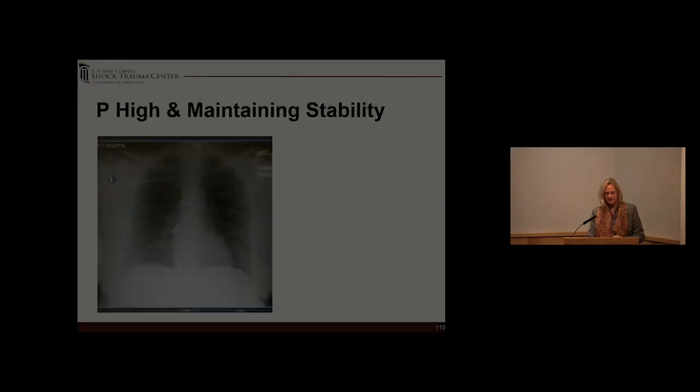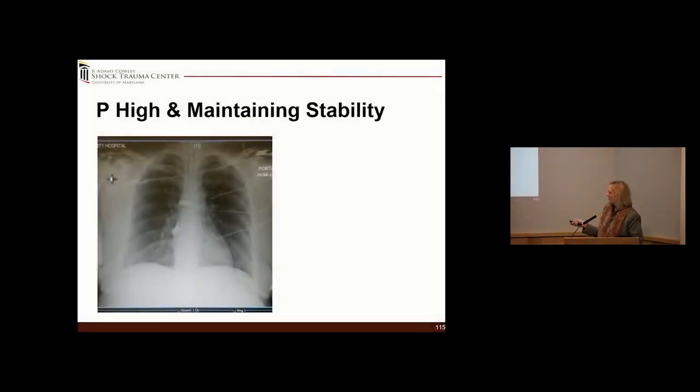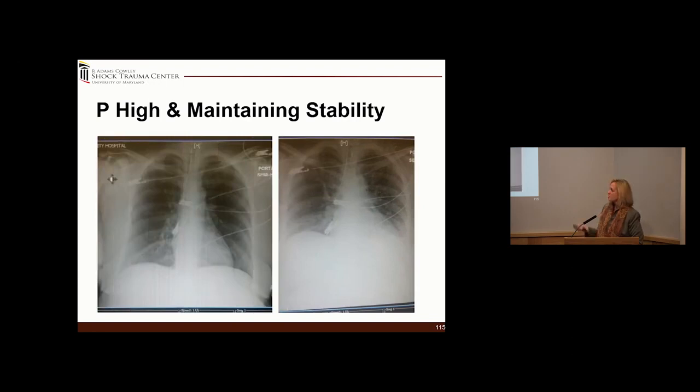And this is an example of a patient that actually was taken off of APRV. Everything looked good. The blood gas looked good. The chest x-ray looked good. This is after 2 hours. Bibasilar collapse. So this was a broken lung. It was not ready to have the cast cut off yet. So that's just one thing to look at. Everything can look beautiful, but temper your desire to immediately take them off.